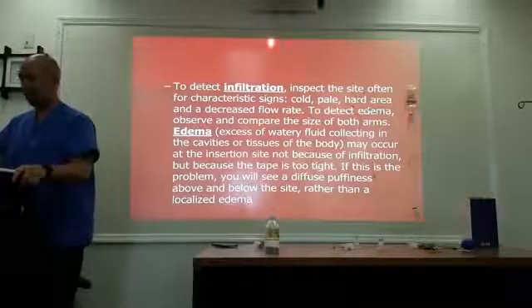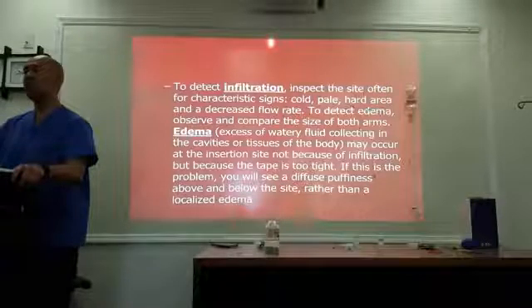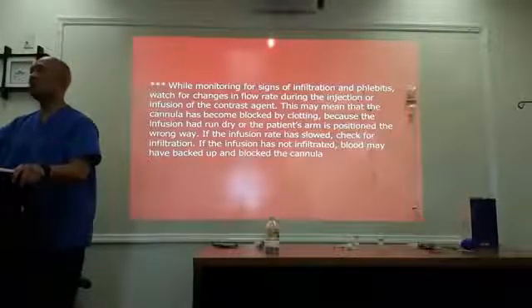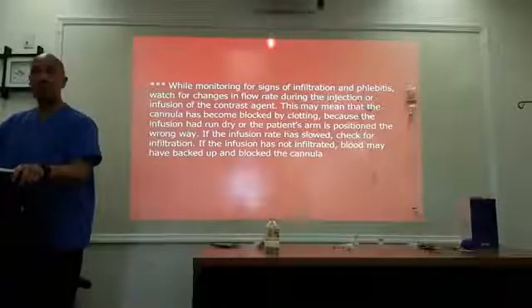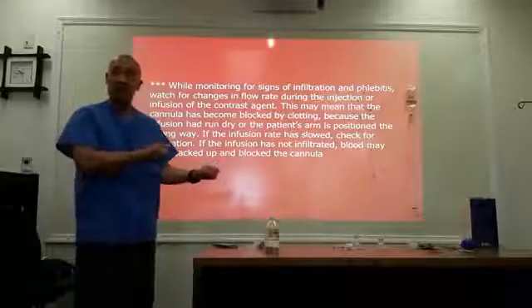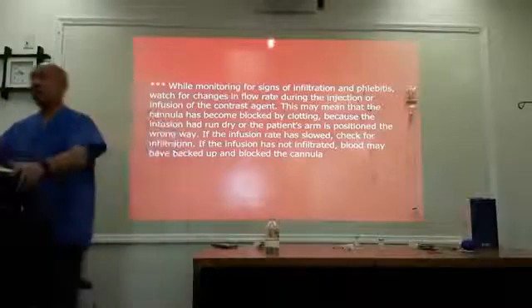If the tape is the problem, you will see diffuse puffiness above and below the site rather than a localized edema. So it's concentrated. While monitoring for signs of infiltration and phlebitis, watch for changes in flow rate during the injection, because infiltration and phlebitis will change the flow rate. If you're looking here and all of a sudden it stops dripping, oop, there's something wrong. Or if you're injecting and you're feeling resistance and the patient's yelling, stop, it hurts, that's a problem. You need to stop.